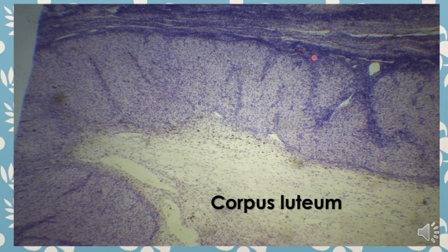Dark staining, periphery, and located between the folds of the granulosa cells. This is the theca lutein cell, while light staining and hypertrophic cells are called the granulosa lutein cells.